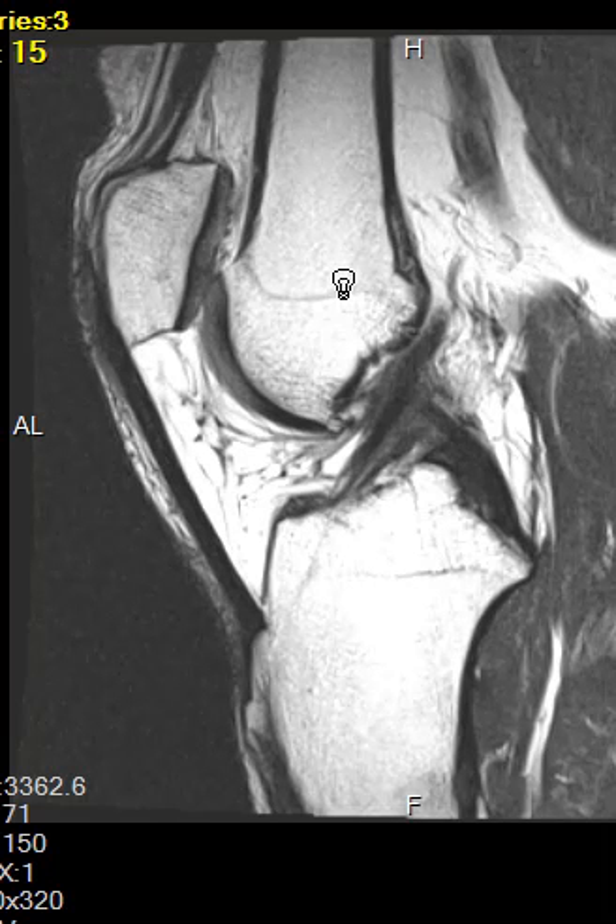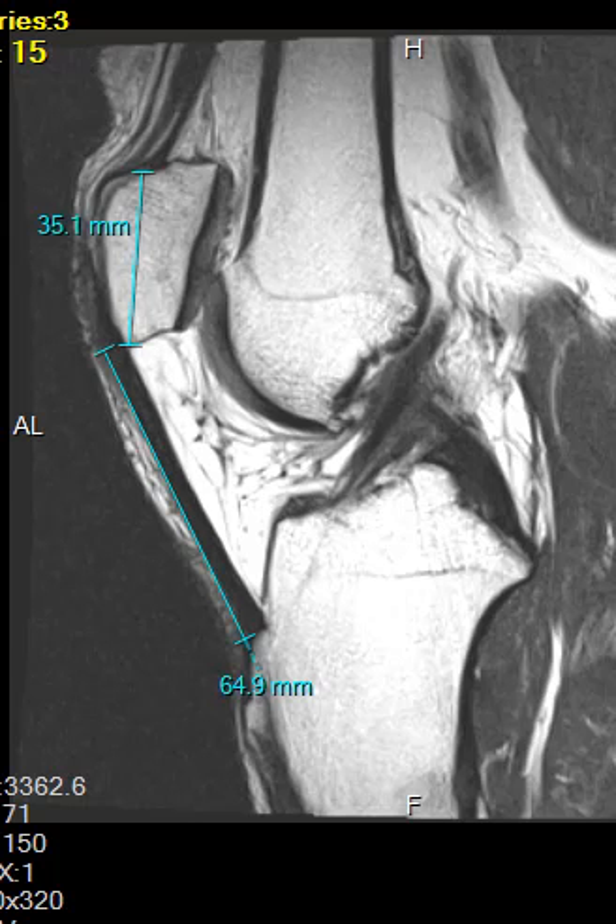This is what they call patella alta — high patella. Typically the patella is considered high if the patellar tendon is more than one and a half times the height of the patella. So if the patella is three centimeters, the patellar tendon should be between three and four and a half centimeters — one to one and a half times the patellar height. In this one it looks like it's about double the height, and when we measure it, it is more than one and a half times the height, though not quite twice the height.